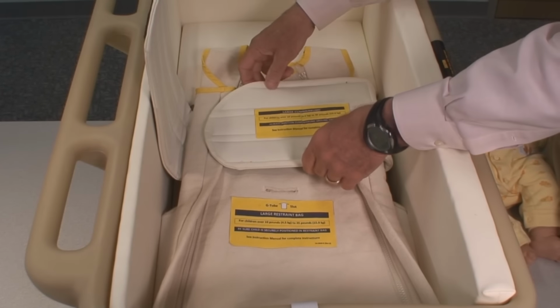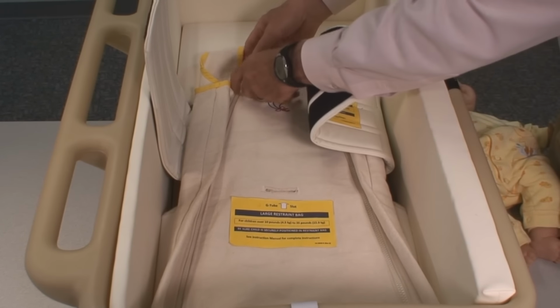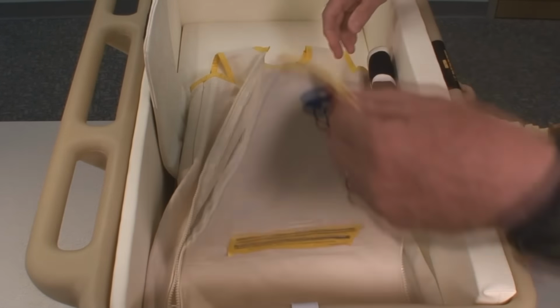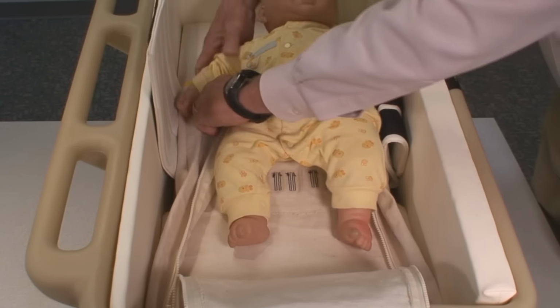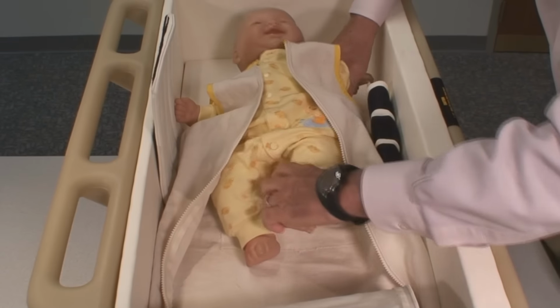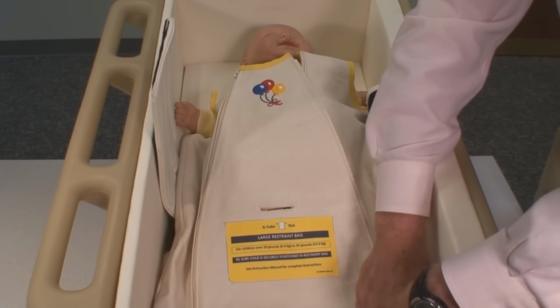With the restraint bag and the cummerbund installed, we're now ready to install the child. You open the restraint bag. You have a dual zipper to lay the flap open. Install the child. Run the arms through the arm slots. Close the flap. Close the zippers.